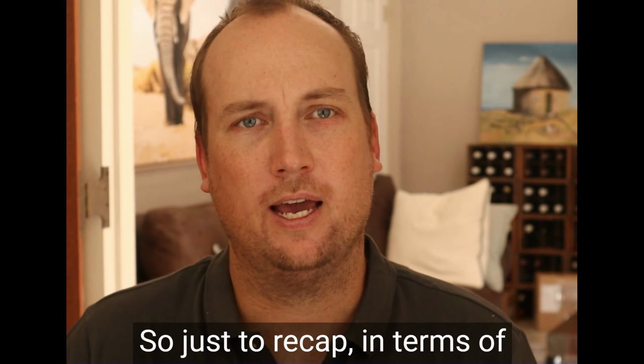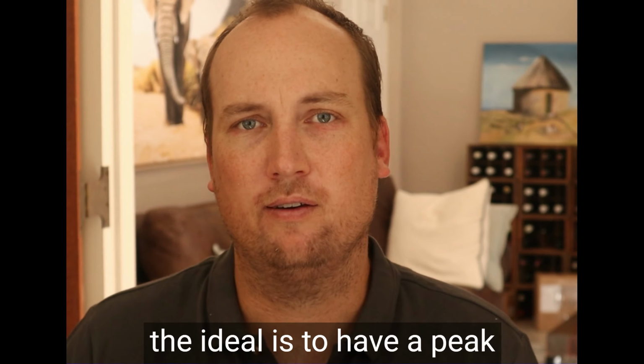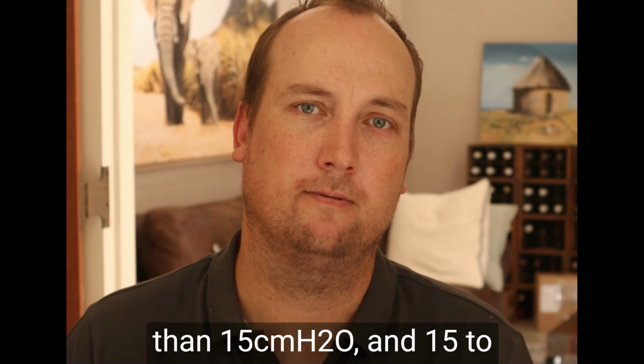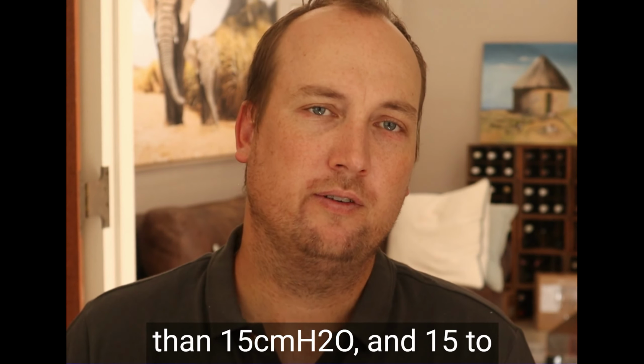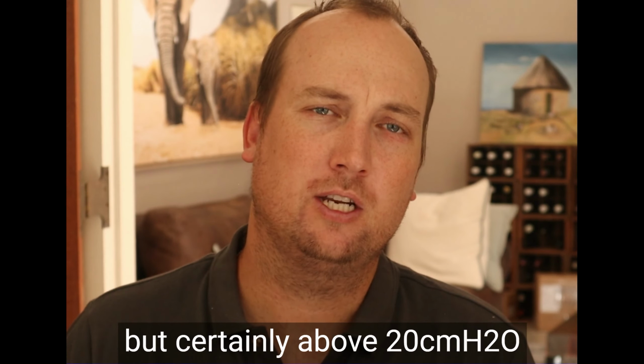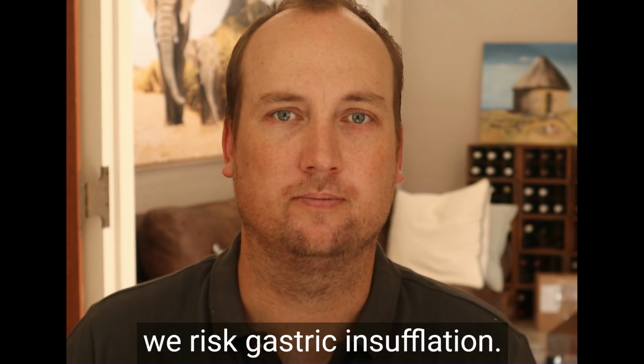So just to recap, in terms of supraglottic airway devices, the ideal is to have a peak inspiratory pressure of less than 15 centimeters of water. And 15 to 20 centimeters of water is a bit of a gray zone, but certainly above 20 centimeters of water, we risk gastric insufflation.